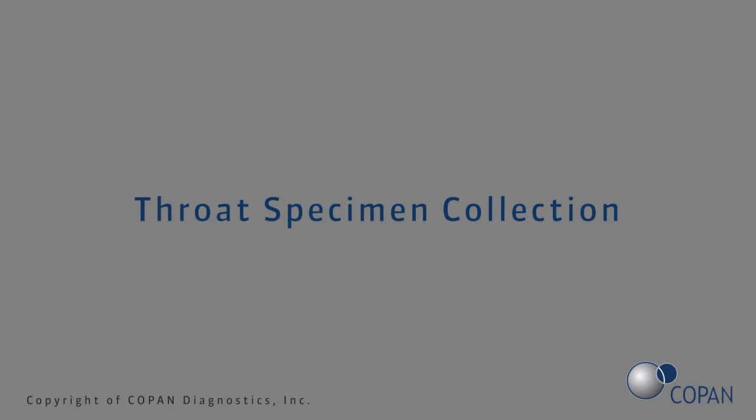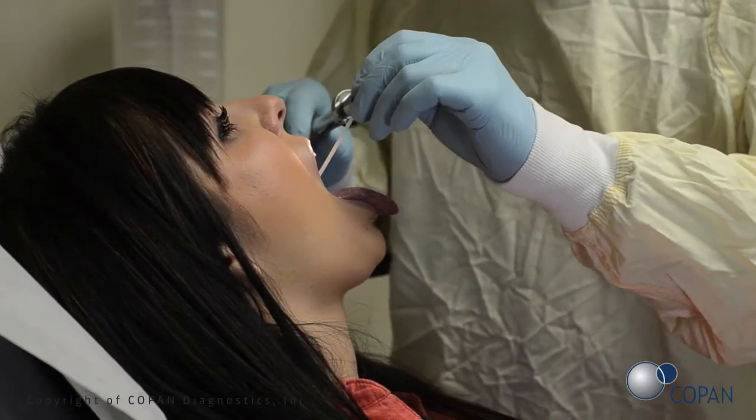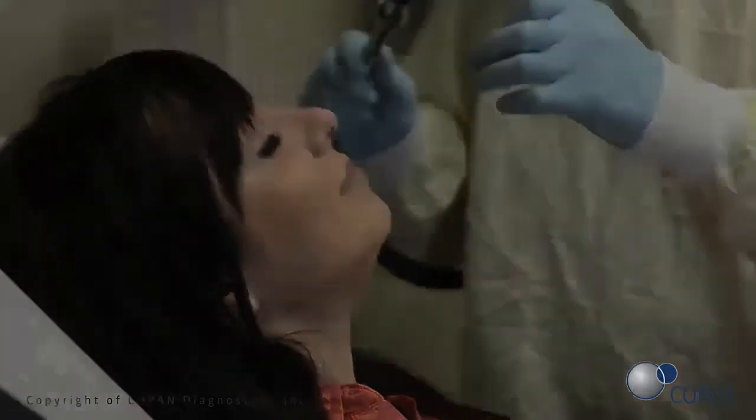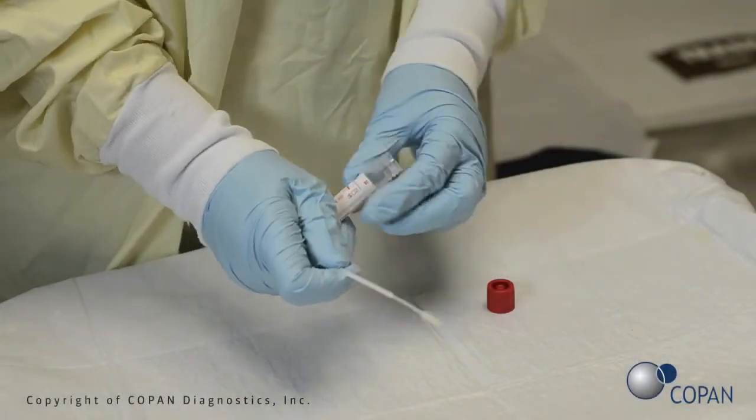Next, to collect the throat specimen, instruct the patient to tilt their head back. Rub the swab up and down against the back of the throat, avoiding the tongue and cheeks. Gently remove the swab and perform the test according to the manufacturer's instructions.